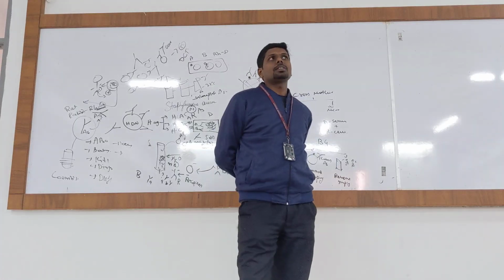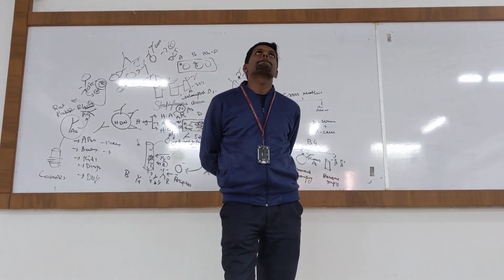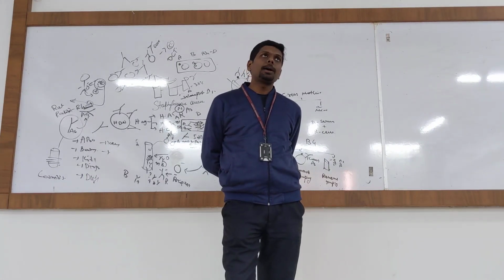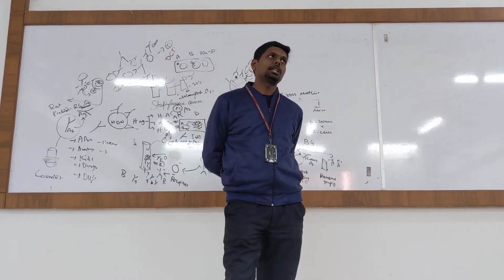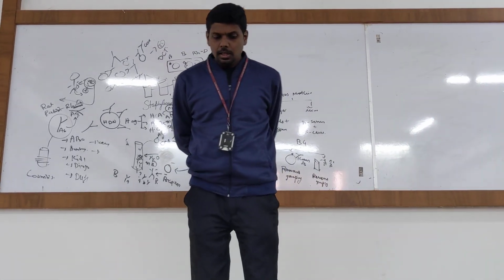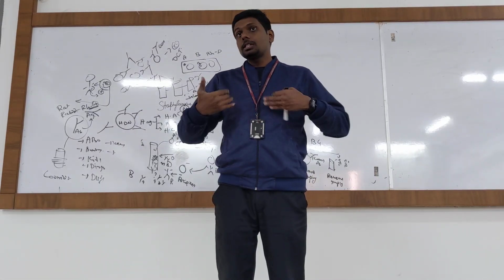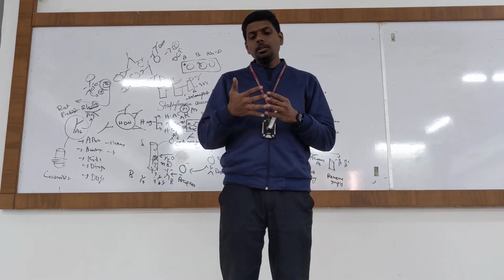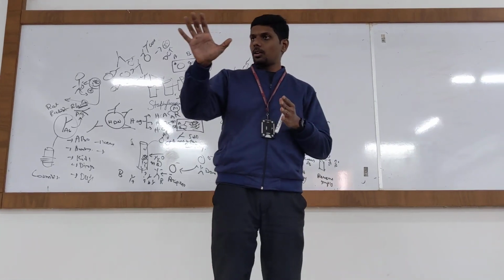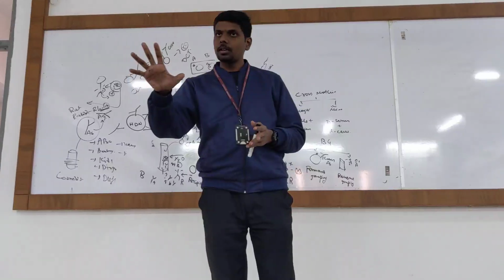For that, you need to discuss some immunology. Cold agglutination, warm agglutination. There are two types of agglutination. Sometimes this antibody reaction happens at warm temperature, that is inside the body. When you have taken blood into a cold packet, the antibodies are neutralized.